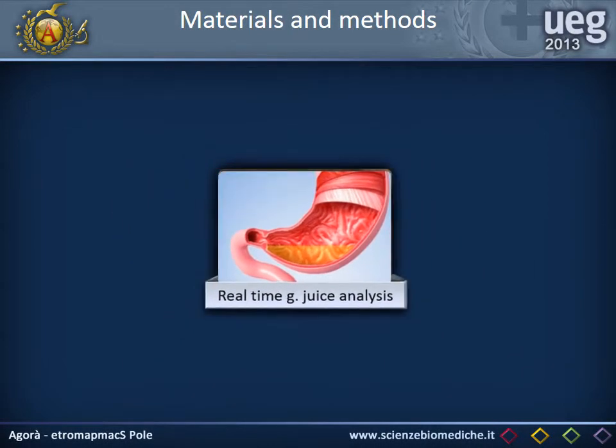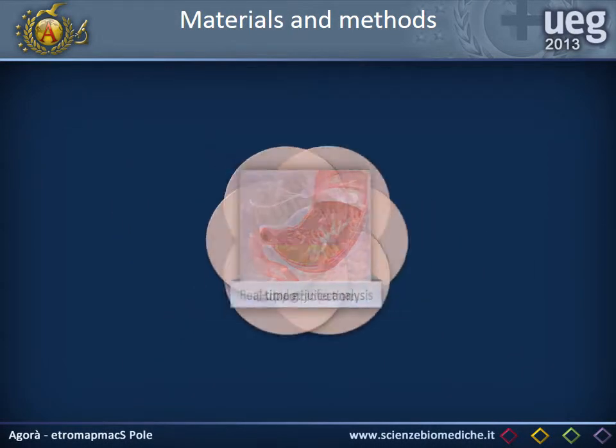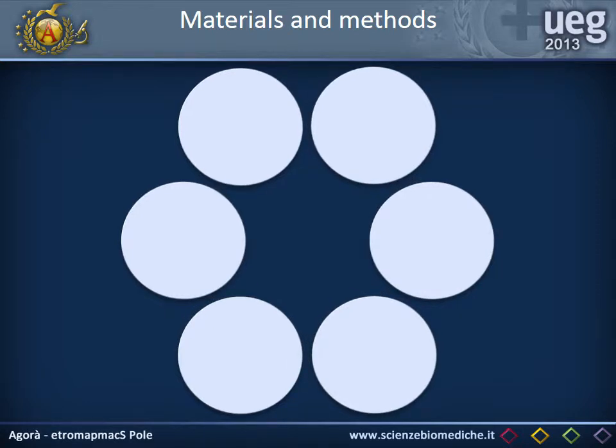Then, taking all the data from endoscopic information, real-time gastric juice analysis, and histologic evaluation, we simulated six different diagnostic strategies, each including only part of the overall investigation employed. Three of these strategies are based on routine endoscopic practice, while the other three are based on real-time gastric juice analysis.